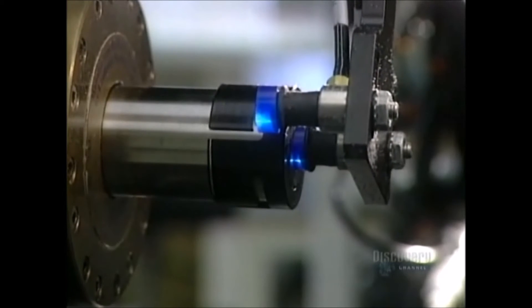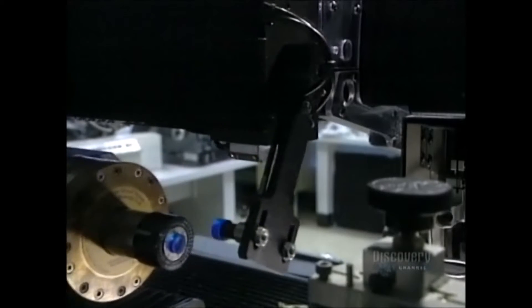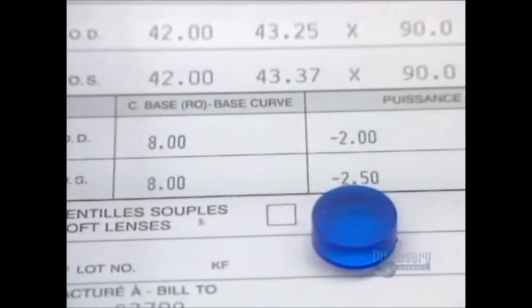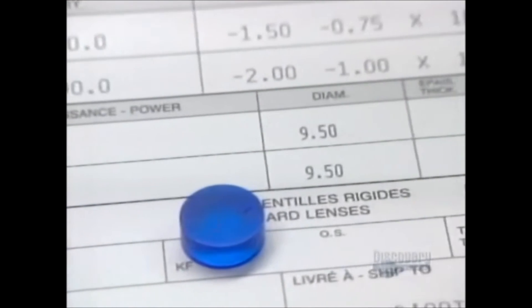These small polyhema discs are used to make soft polymer contact lenses in a variety of colors. We see here a patient's prescription, essential to the fabrication of lenses.